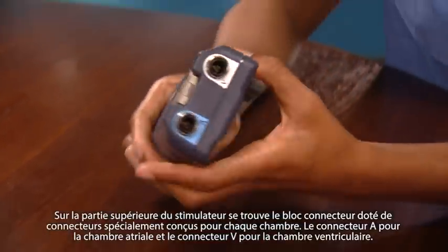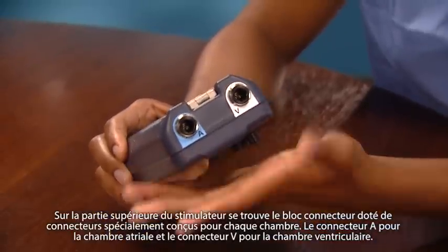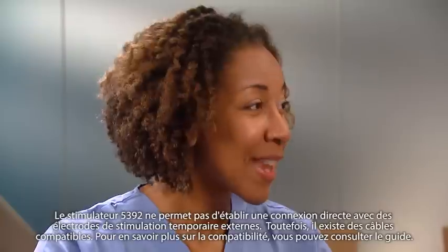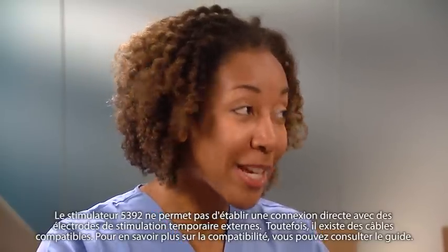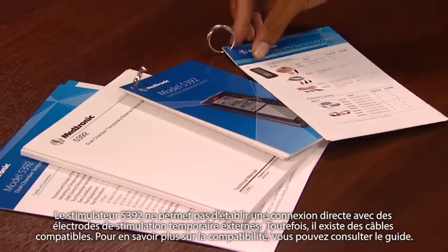Also, on top of the device, the connector block has sockets designed for each chamber: A for atrium and V for ventricle. Notice the sockets are color-coded — blue for atrium and white for ventricle. The 5392 does not support direct connection to external temporary pacing wires; however, there are compatible cables. For more information on compatibility, you can check the guide.